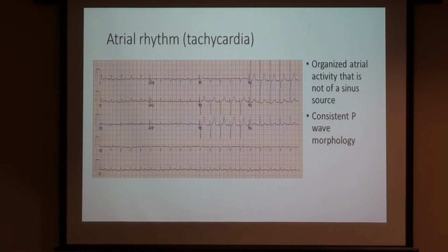All right, we talked about atrial rhythm that was multifocal, one that's unifocal. All right, the same P wave morphology all the way across, right? It's upside down in lead 2. Boom, not sinus, period. It's not sinus rhythm. It's sort of isoelectric in lead 1, so the axis for this thing is probably straight up. So the PR interval is really short. So the origin of this thing is right next to the AV node. That's where it is, and you can ablate these things.